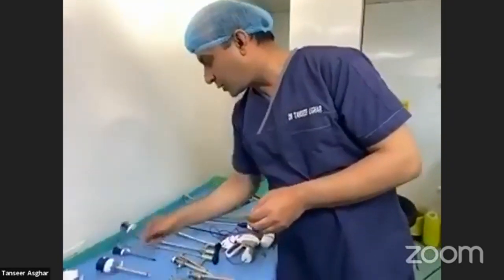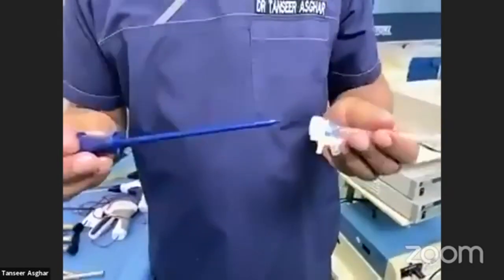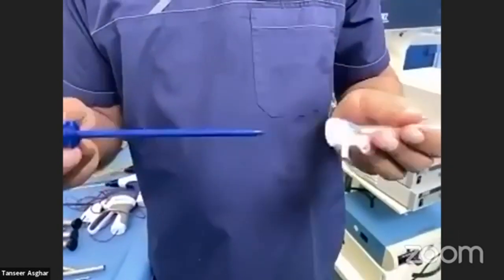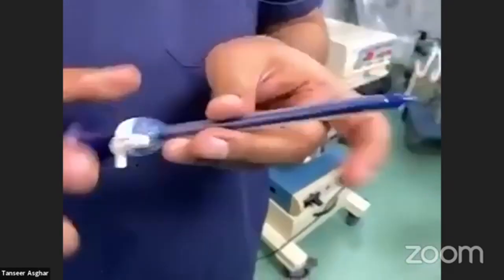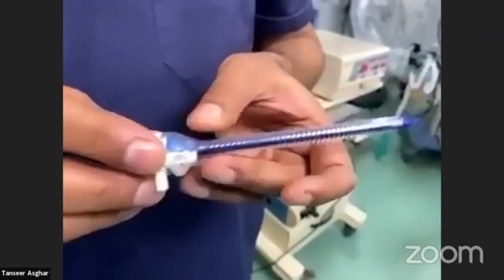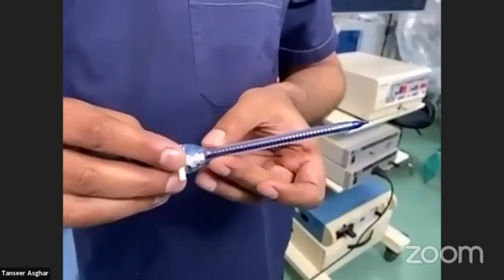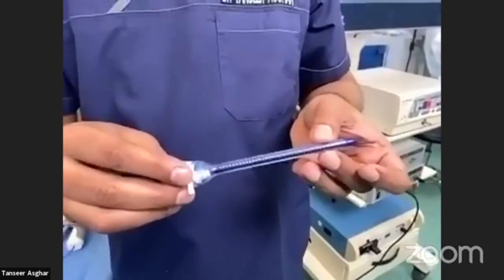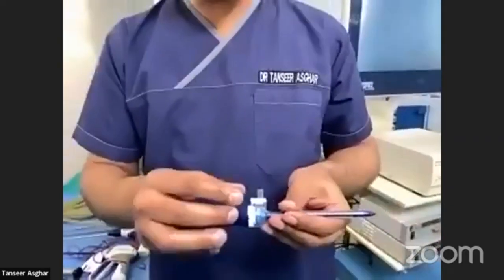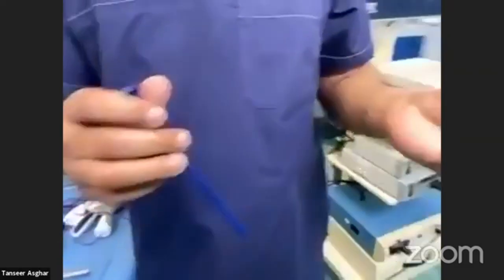In the disposable range, there are also five millimeter trocars with almost the same mechanism and a pyramidal-shaped trocar tip. The port cannula has ridges and is five millimeters in diameter, about 13 to 15 centimeters in length, depending on the company. There is a valve and an entry point as well.